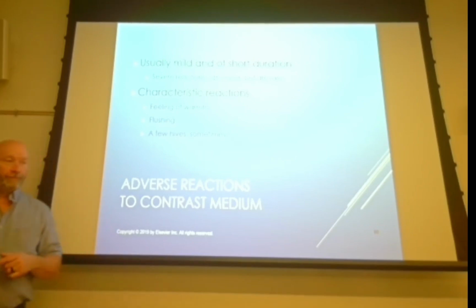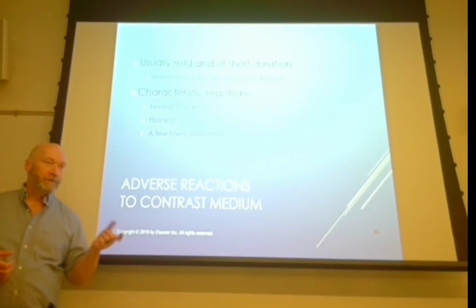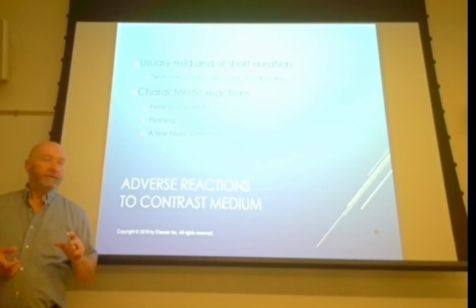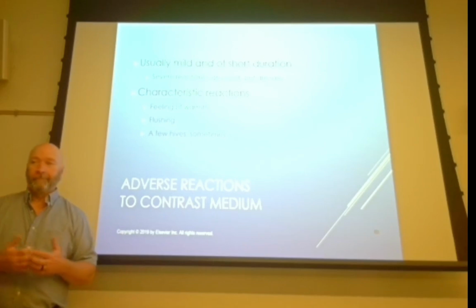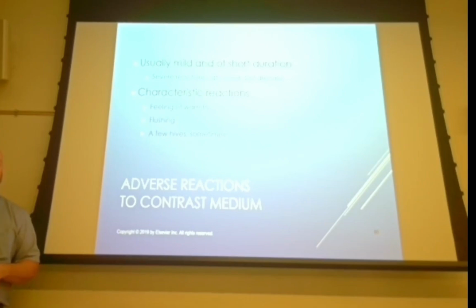So we inject the patient. Before you inject the patient, you're going to ask the patient the questions that you need to ask, and you need to describe what's going to happen. But what you don't need to go into in depth is the potential interactions. You don't want to be holding the patient's luer lock, screwing your syringe onto it and say, you could die from this, right? Because now what's the patient thinking? I'm gonna die, right? And they can talk themselves into some sort of reaction.